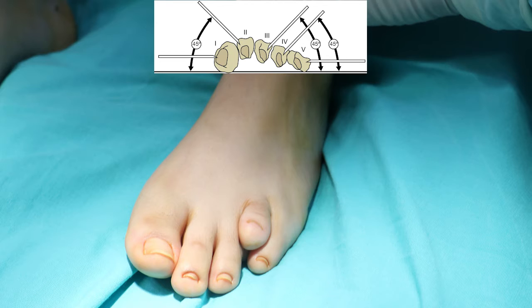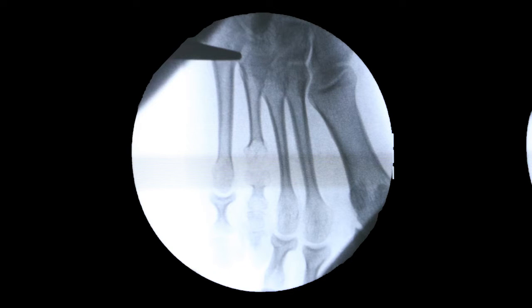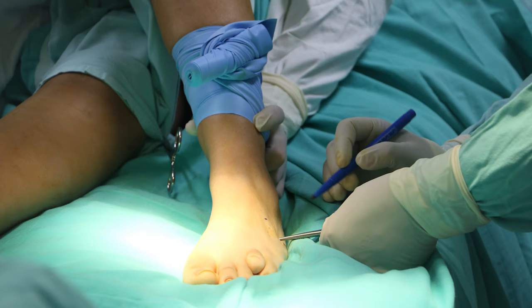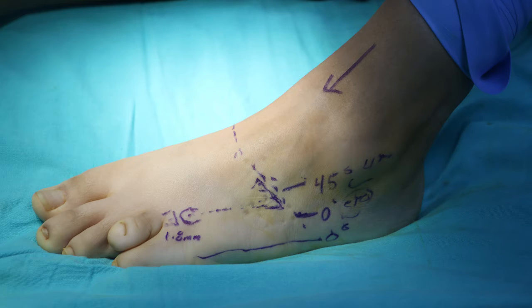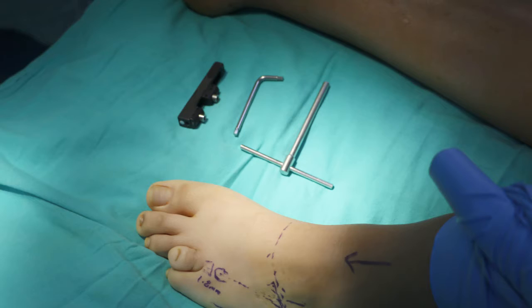The previous surgical protocol places the patient under epidural block in dorsal decubitus position, with the foot free and easy to move. The next step is to locate the base of the 4th metatarsal clinically and radiologically. The longitudinal plane of the 4th radius of the foot is obtained, and at 45 degrees the foot is incised to place the first screw of the initial clamp at the base of the 4th metatarsal.